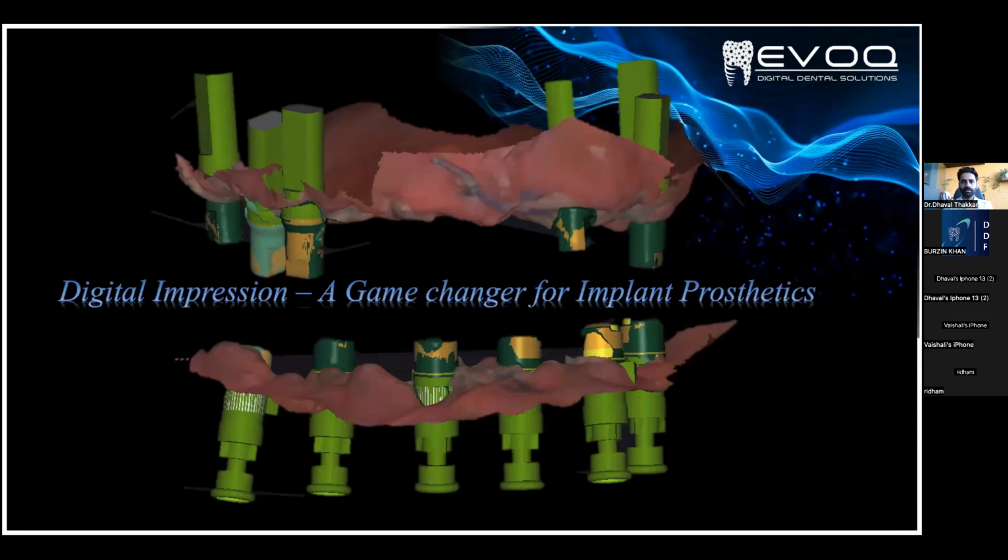Implant dentistry has become much easier with the intraoral scanner, if the scanner is operated by a good scanner operator, and the designer or laboratory technician is that smart, because we see a good number of failure cases as well with the intraoral scanner compared to conventional techniques. In a particular case, if we are scanning more than 4 or 6 implants, we are going to get trouble during the final fitting or during the metal trial.